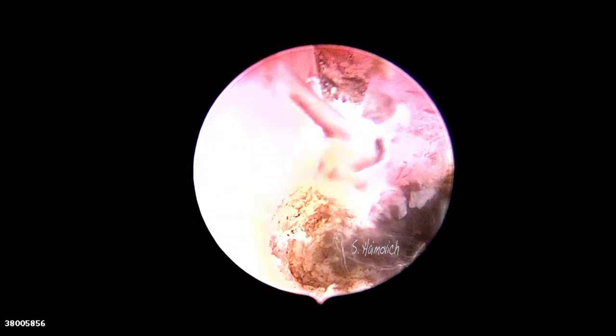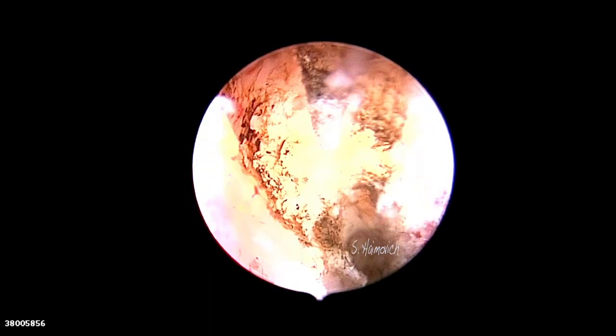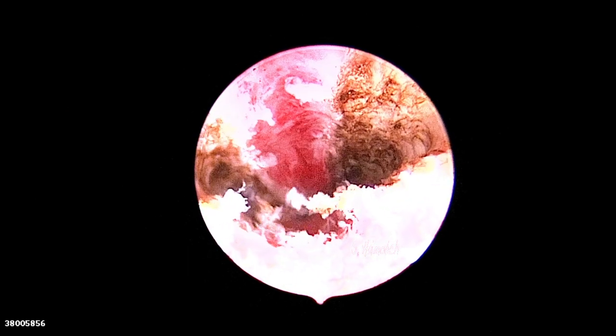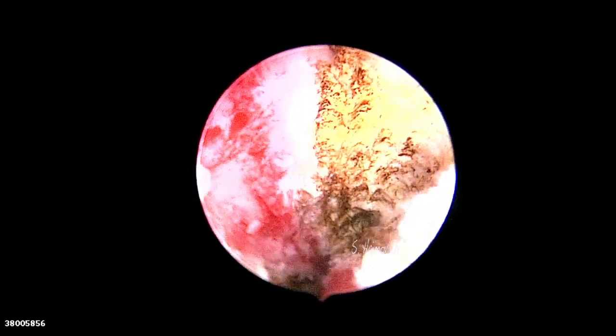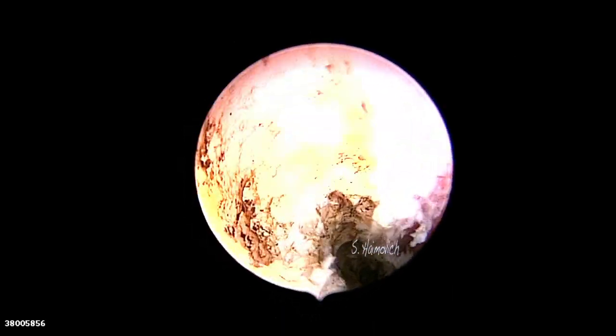The increase of the volume of the cavity is seen during the procedure. We work with a low pressure of 80 millimeters of mercury. At the end of the procedure, the left tubal ostium is placed, as you can see, in the center of the fundal wall. There is a remnant of endometrium in the anterior and posterior wall.